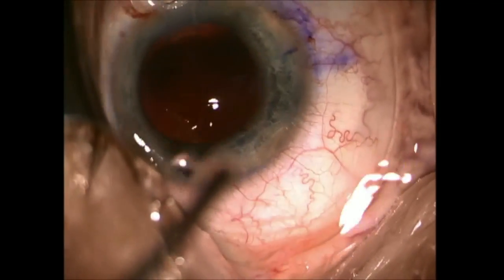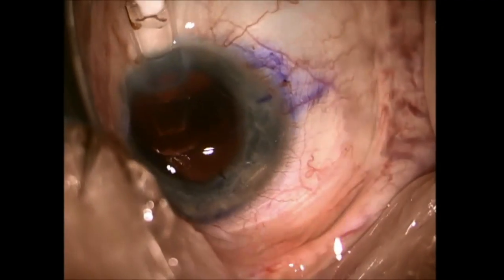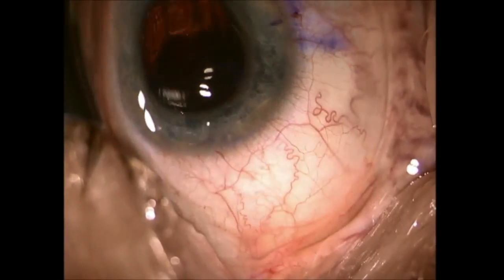Each implant has its own delivery mechanism. This is a crystal lens, which is a one-piece accommodating implant. It has two orange haptics. We sometimes refer to it as the orange mustache.